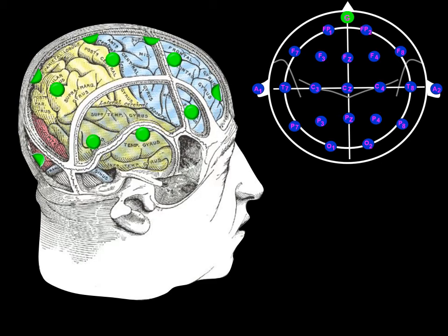In this frame I have added the common locations of the most frequently used electrodes. I have in this frame labeled the C4 and F4 electrodes.